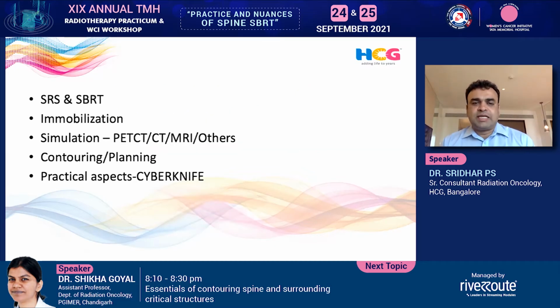So I'm going to talk about SRS and SBRT in general, and immobilization technique, which is the key to the success of any SBRT program. And simulation, where we usually talk about PET CT, MRI, CT and MRA, where to do it and when to do it, and what all the pluses and minuses are. Contouring and planning is also important, and the practical aspects of my experience with CyberKnife for SBRT spine.